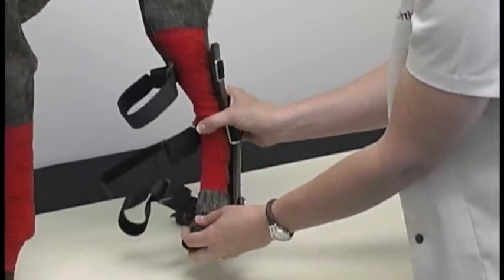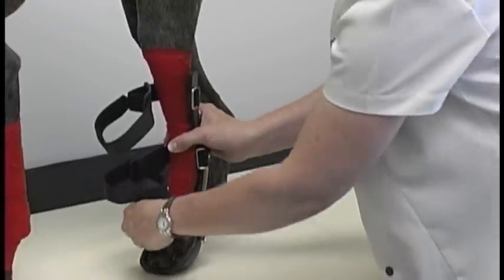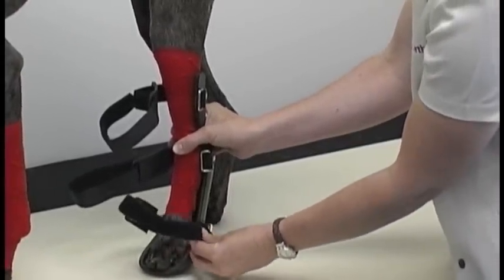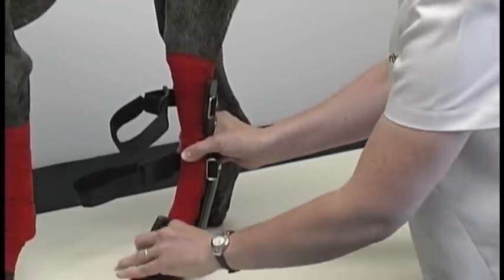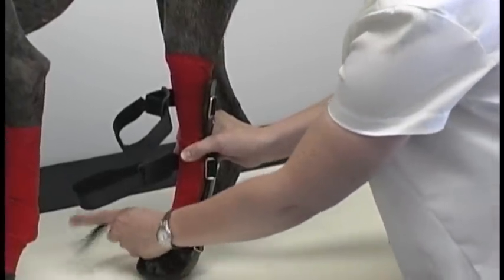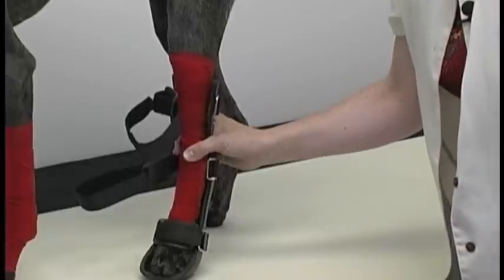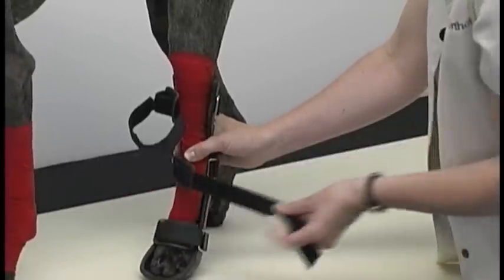Again, it's always helpful to have somebody distracting with treats. We are going to start with the bottom strap — go through the buckle and snug the strap down over the top of the paw. That secures your fit. If the dog is moving around, that bottom strap is secure and it will not let the splint slide around.